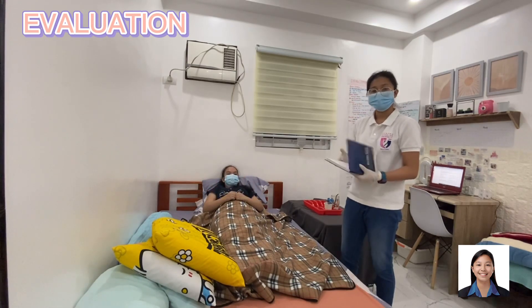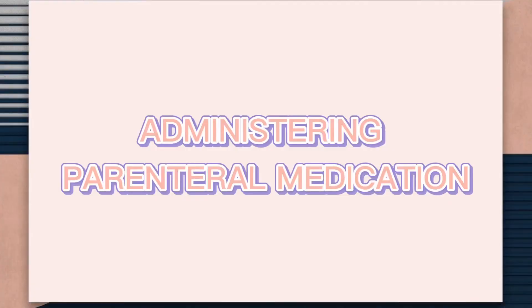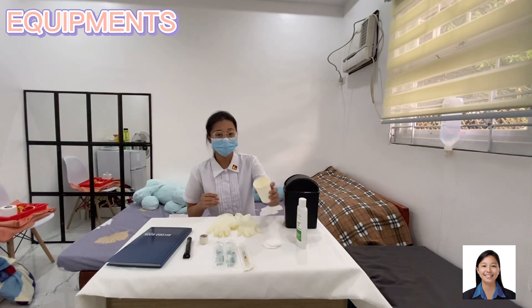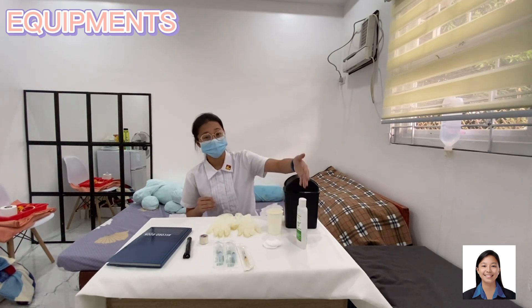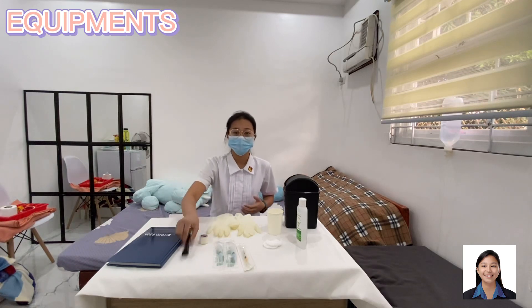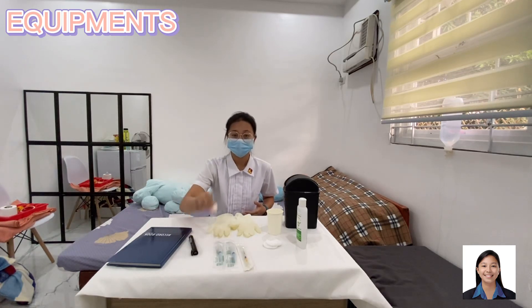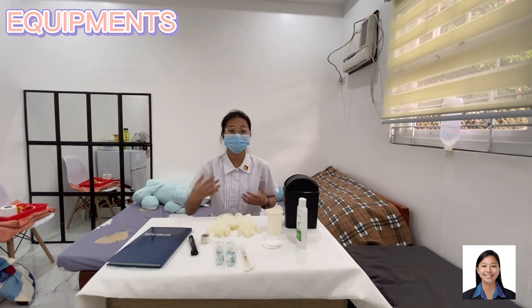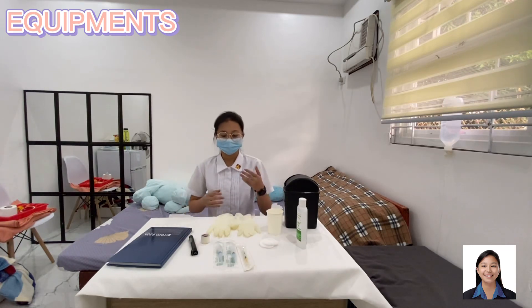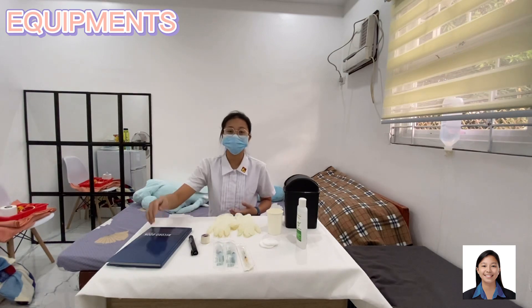Now, I will be demonstrating how to administer parenteral medication. What we will need are syringes, cotton balls, alcohol, waste receptacle, marker, tape, gauze, cleaning gloves, and the medication administration record.